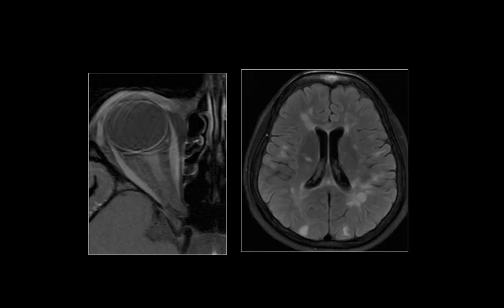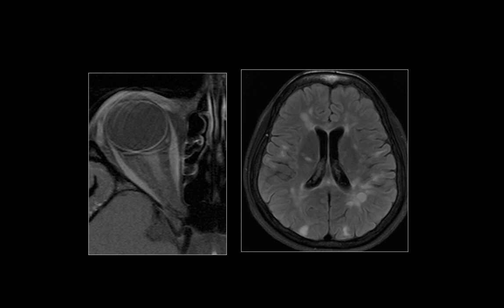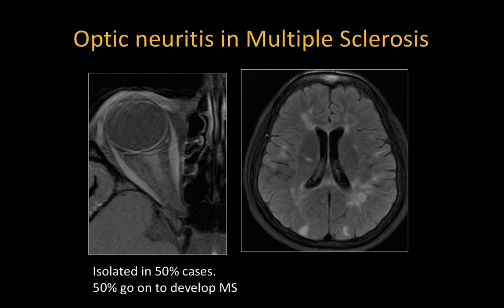Optic neuritis can be idiopathic in 50% of cases, or it can be associated with various demyelinating syndromes. In this case, only the anterior part of the intraorbital segment of the optic nerve is involved, and the rest is spared. This patient also had multiple plaque-like lesions in the periventricular white matter perpendicular to the lateral ventricles, with multiple juxtacortical lesions. This is classic multiple sclerosis.